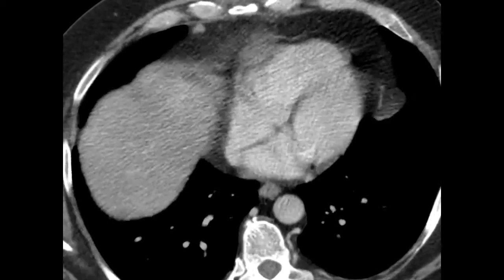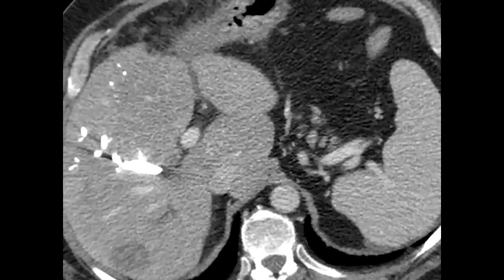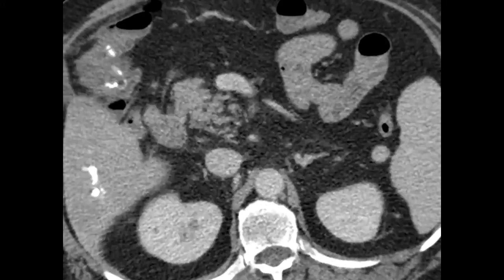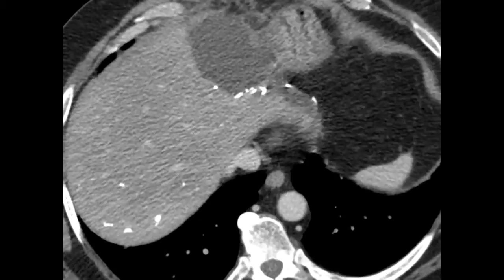Here is the CT scan 6 weeks post-embolization and partial resection of segment 2. We can see the Glubran and Lipiodol. The result is very good as well. The desired branches are occluded and there is a hypertrophy in segment 1 especially, as well as segment 2 and 3 when comparing to the pre-interventional imaging.